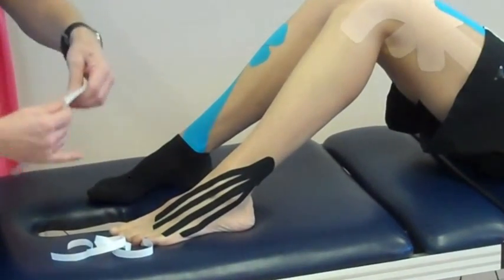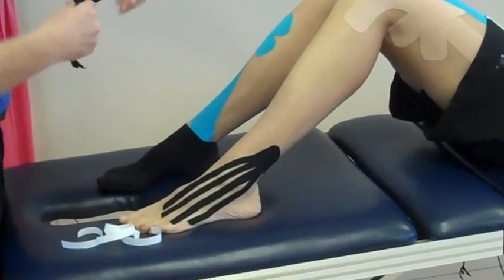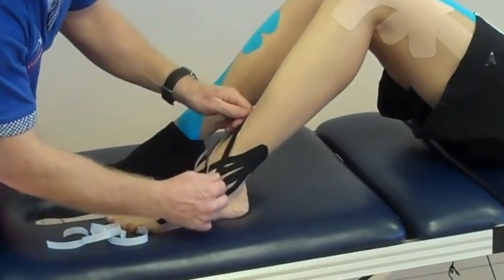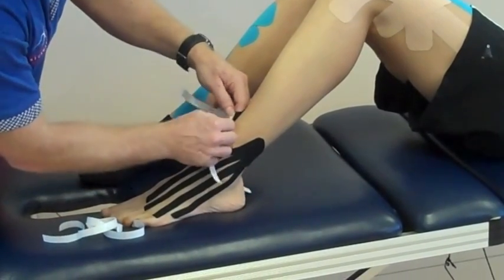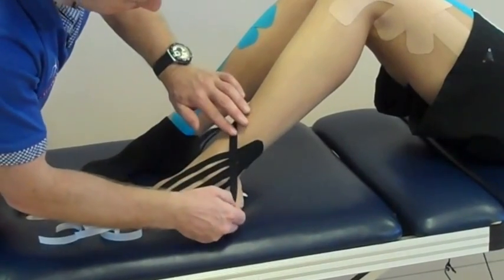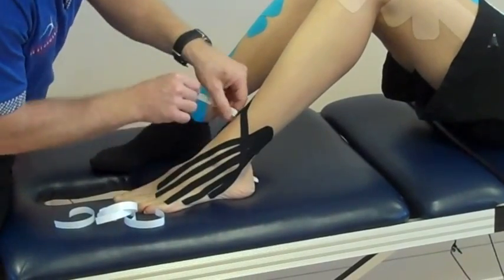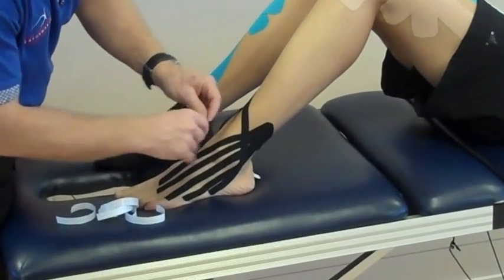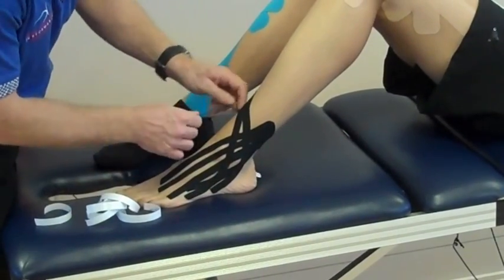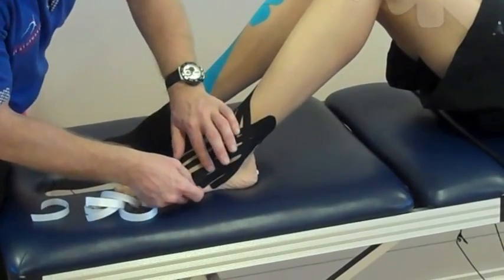And then the second strip, you can split again and then you're going to go more towards the side. And the third one — if you want it to go under the foot you can, but sometimes it's better just to mold it.